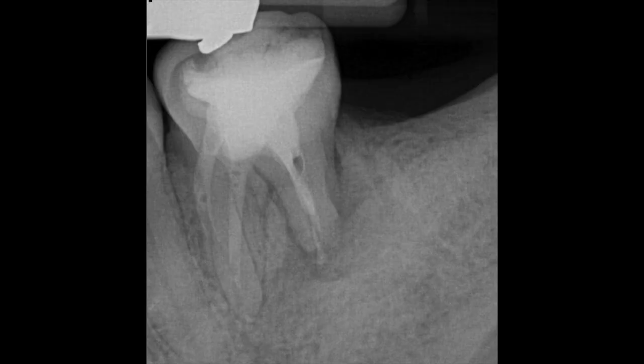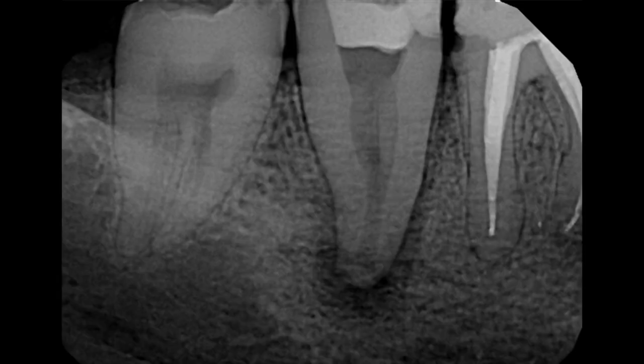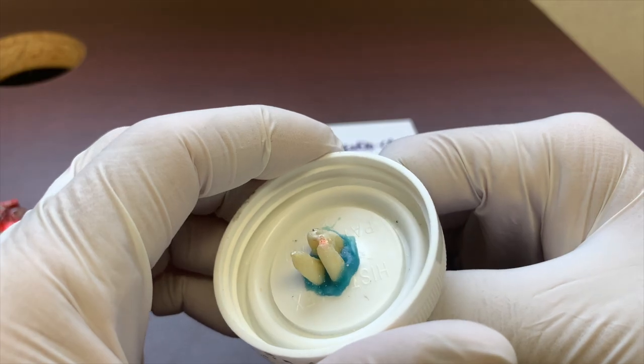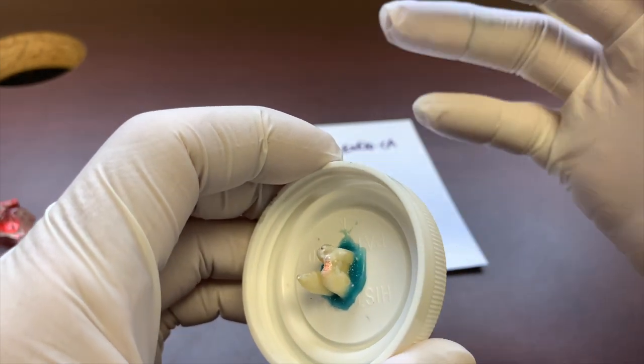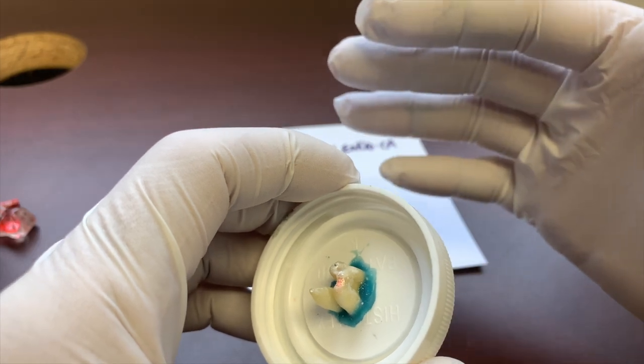So, for example, you've got a large lesion that resorbs some of the root, or the canal is just super large, and you want to make sure that you're getting adequate debridement. We want to make sure that we're getting success. I think that's the biggest thing I need to bring home: you want success, you don't want the patient to come back with problems.